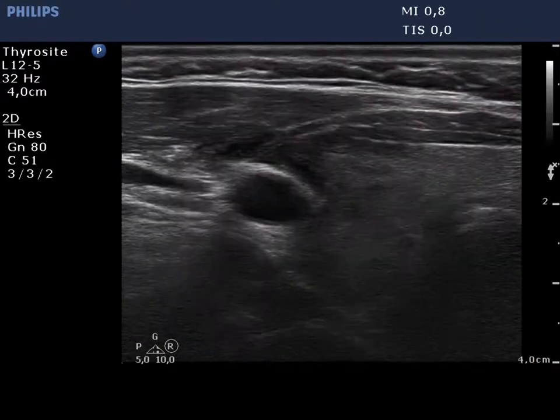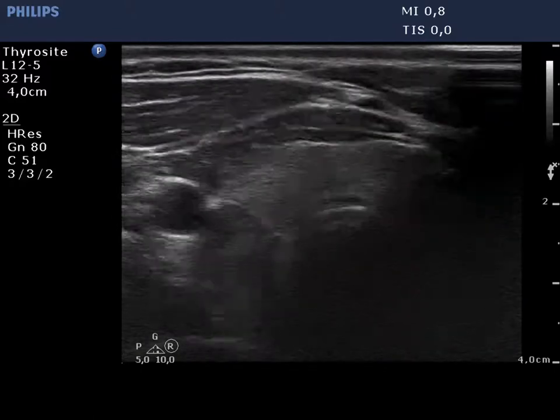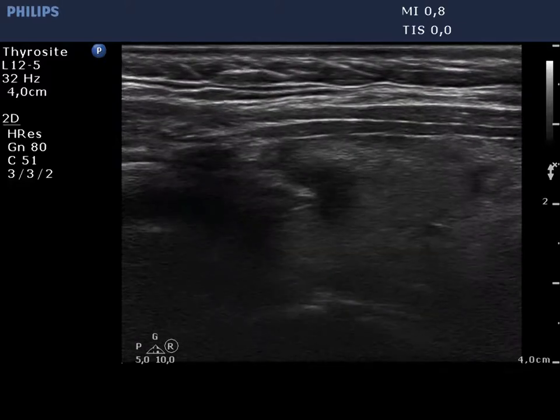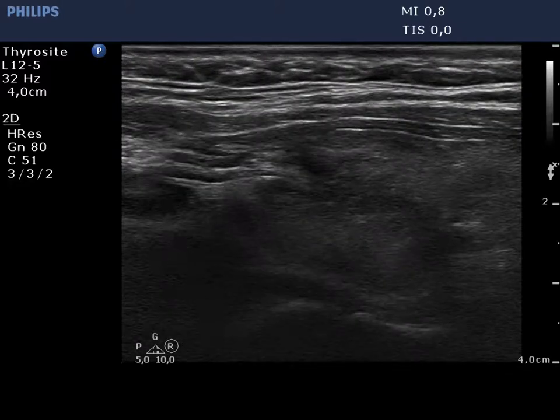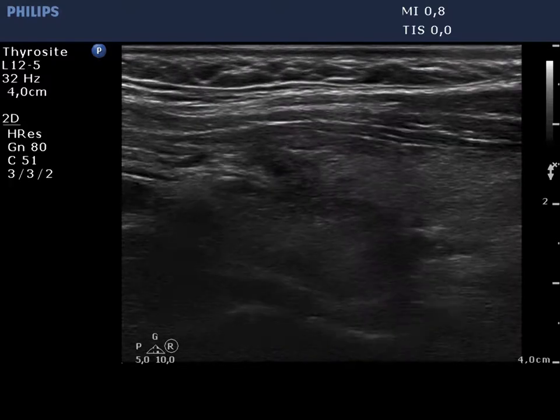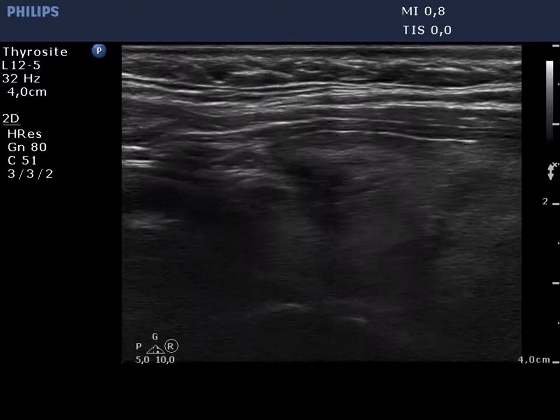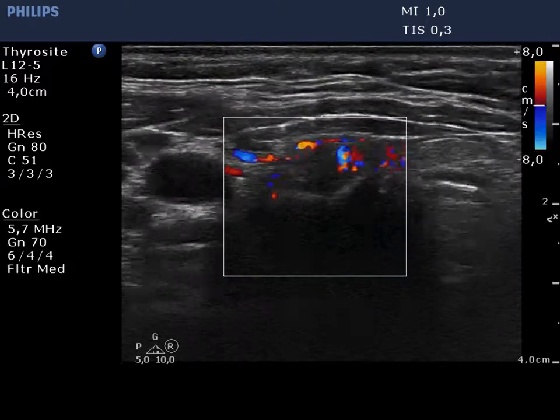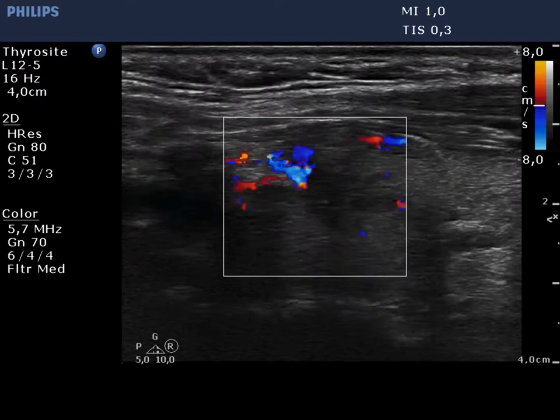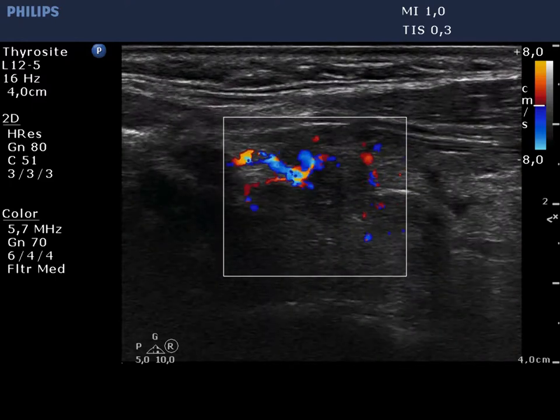The right thyroid is minimally hypoechoic and has tiny hypoechoic areas. The echogenicity index is below 5%. There is a hypoechoic lesion in the ventrolateral part of the right lobe. The lesion presents irregular, lobulated margins and blurred borders. The intranodular blood flow is increased.